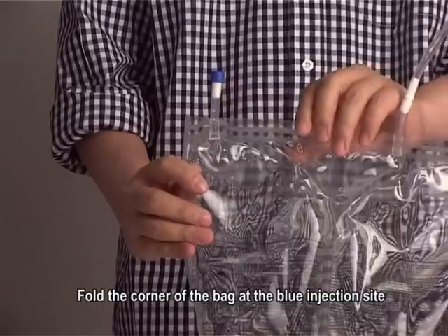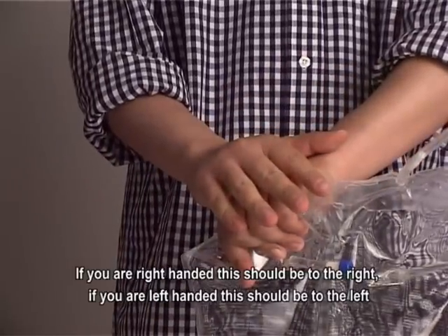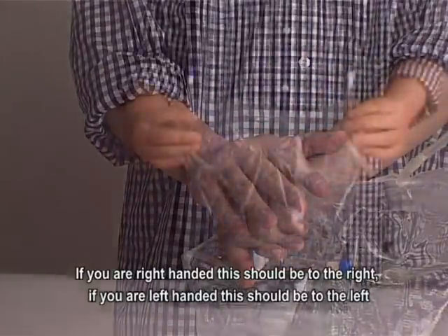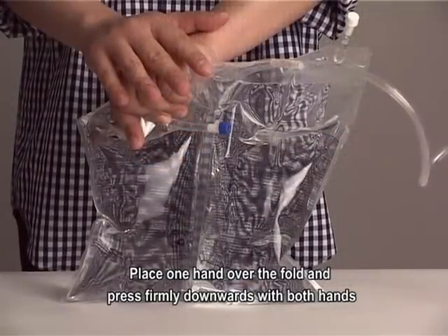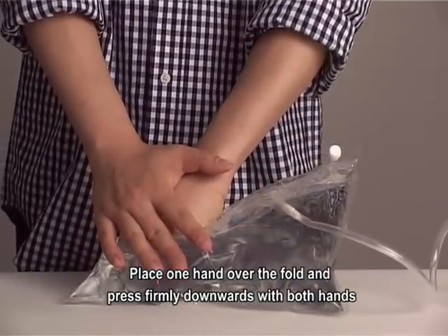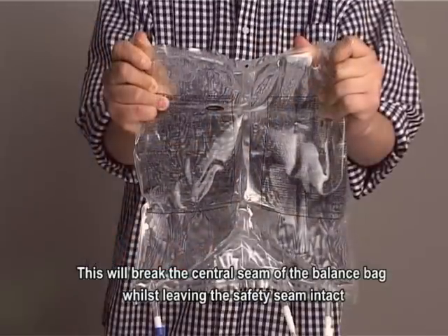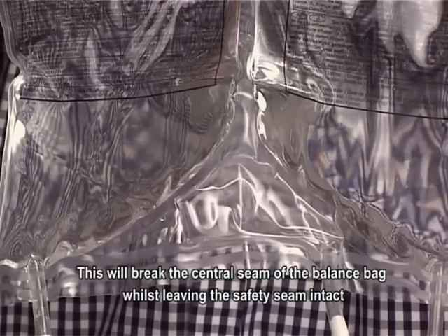Fold the corner of the bag at the blue injection site. If you are right-handed, this should be done to the right. If you are left-handed, this should be done to the left. Place one hand over the fold and press firmly downwards with both hands. This will break the central seam of the balance bag whilst leaving the safety seam intact.